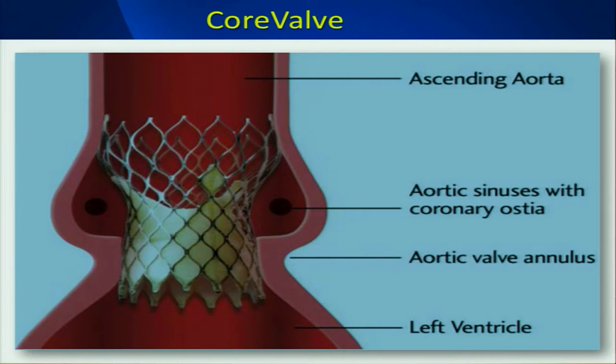But just a random short axis, so when you guys are scanning a TAVR valve and you give us one short axis, it's not very helpful. Now, this is one of the few places where a sweep is actually very helpful. If you show that short axis and you sweep up and down and you demonstrate, as much as you can scan, that there's no leak, that's very helpful. But a single still shot randomly along the short axis, it's hard to know that there isn't something else there.